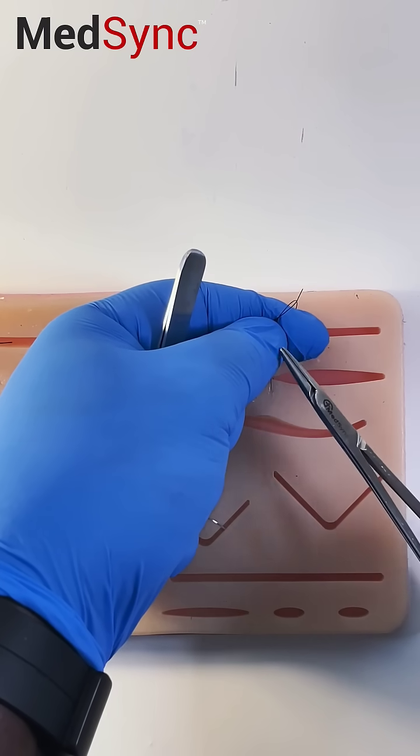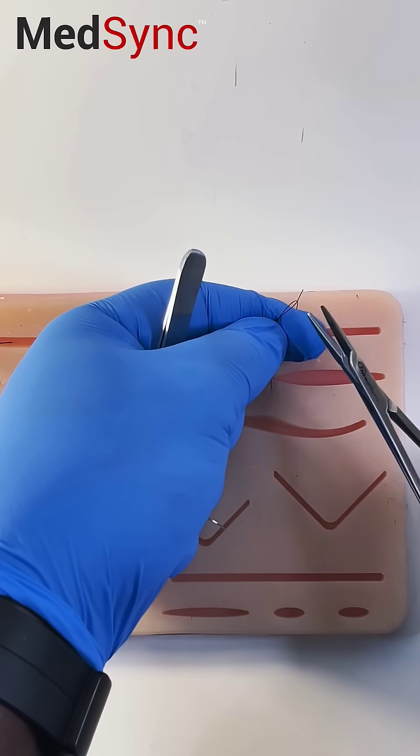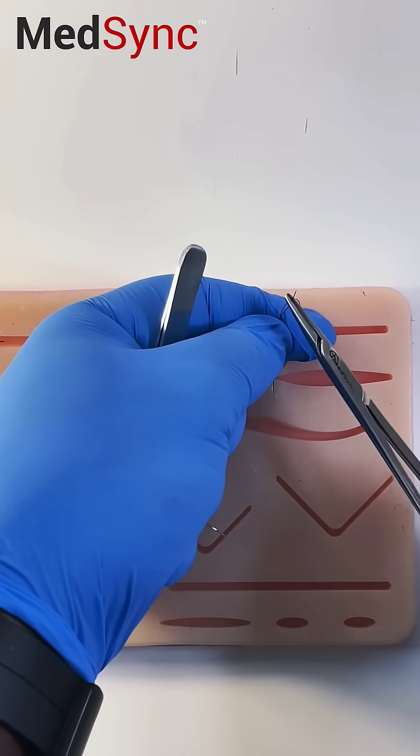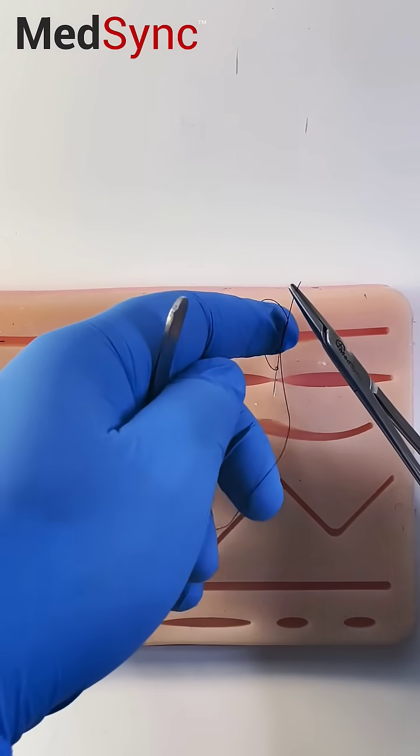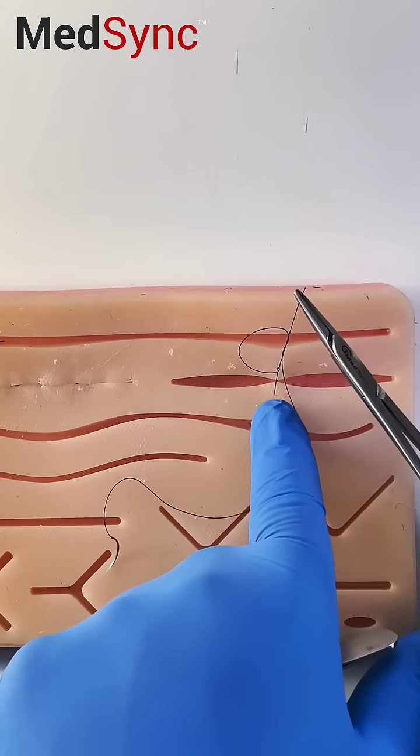Take the tension that you've got between your thumb and index and pull the short suture to keep the knot closed. If you let go, the wound will still remain closed.